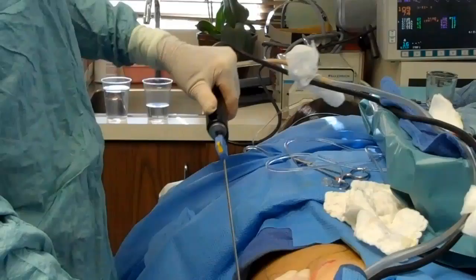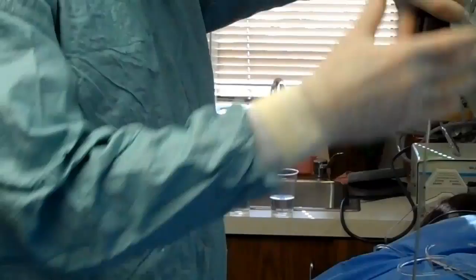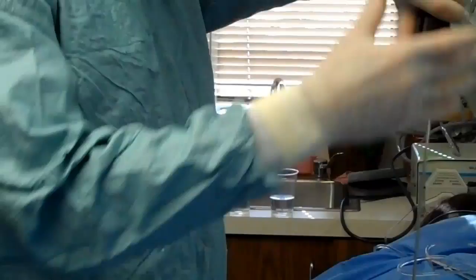Sometimes on the neck area we use a two-millimeter cannula. In the old days we used to do liposuction with cannulas that were five, six, seven millimeters in diameter — we almost never do that anymore.